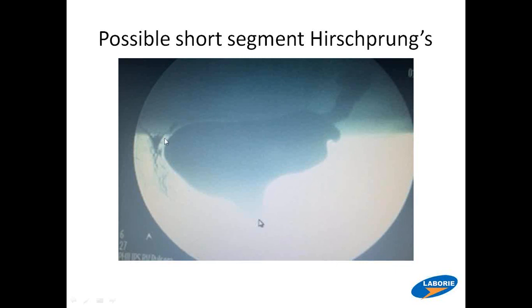I do put a little swish, probably about 5 cc's of barium contrast, liquid contrast, with air behind it to try to get it to coat the posterior vaginal wall so that you can look for things like the effect of this rectocele. Also, an enterocele would push the rectum down and splay apart the rectovaginal septum, which here is very normal. I know a lot of people also on the defecography will give oral contrast. If I strongly suspect an enterocele, I will give oral contrast like an hour, hour and a half before we do the defecography, so all the small intestines is up here, opacified. But you can usually get a hint that there is an enterocele, which is small intestines pushing down into the septum and blocking the rectum. You can usually get that hint on the defecography without contrast.